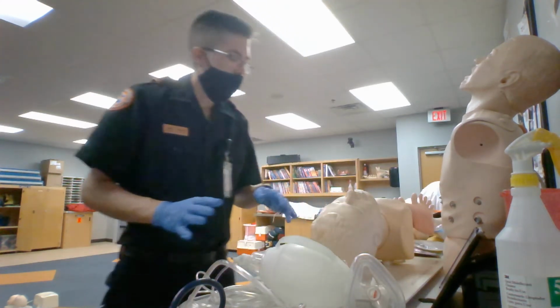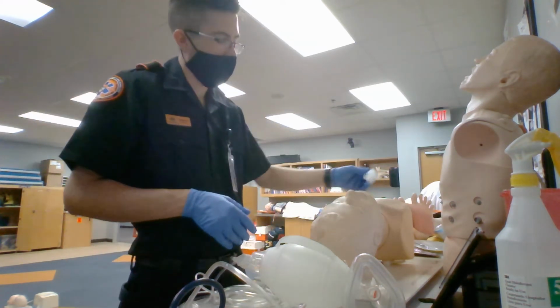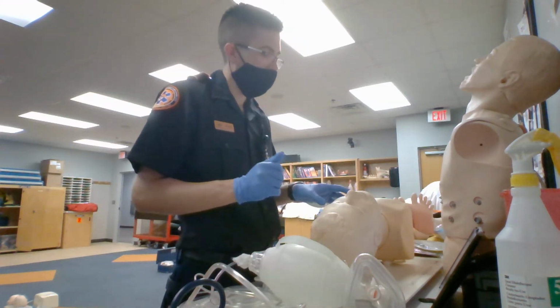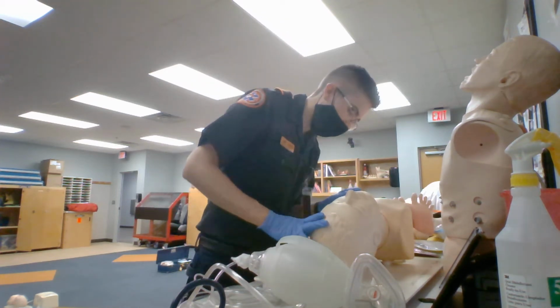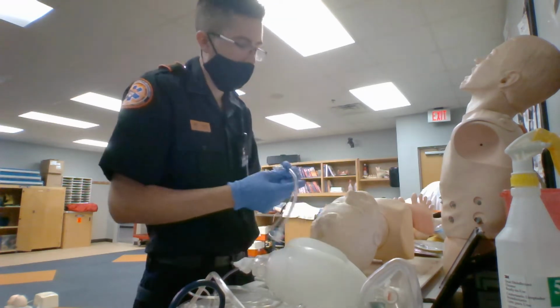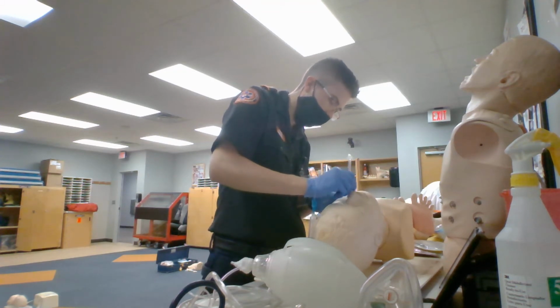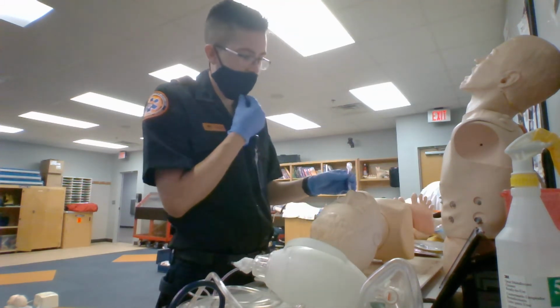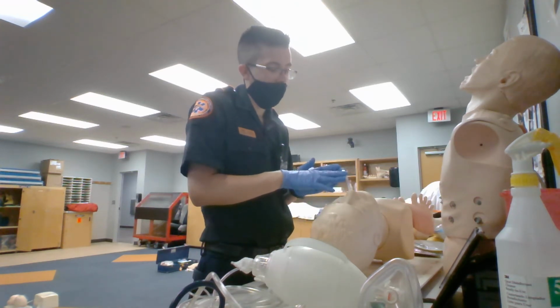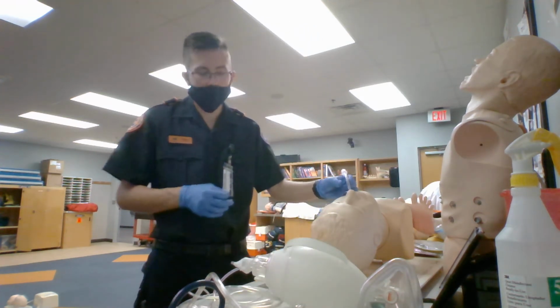another thing that I'm going to do is get prepared for my intubation attempt. So I will remove my OPA. I am then going to come back, re-inspect my nostrils, and then I'm going to prepare my ET tube. I'm going to insert my tubing, and then just as I'm about to pass the vocal cords, I'm going to pause, check to make sure that I can hear airway movement, as well as that there's misting in the tubing. Once I have done that, I'm going to instruct my patient.